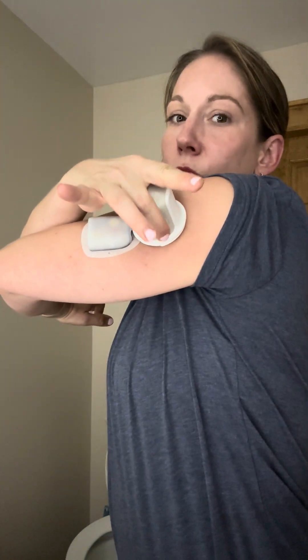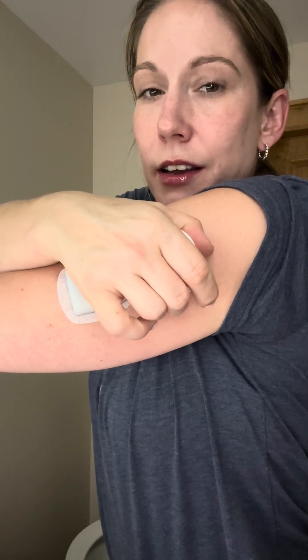Now it's prompting me to put my sensor on, so I'm going to place my sensor next to my pod. With your sensor and pod, you want them to communicate effectively, so they need to be in the same line of sight — on the same side of your body. I could put them both on my left side, or on the back of the same arm. I don't like running the risk of them not being able to communicate, so I like to put them right next to each other. With this you just press it in and then click that white button — ready, set, go — just like that.